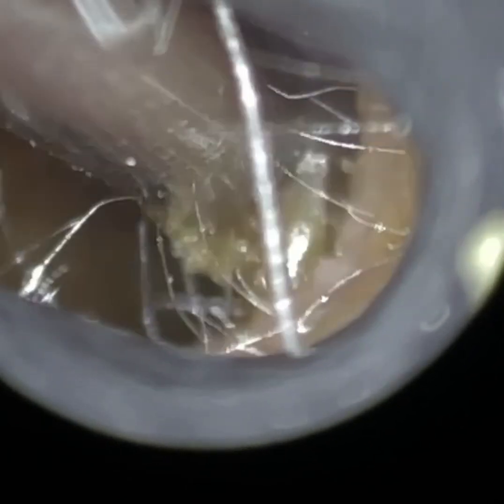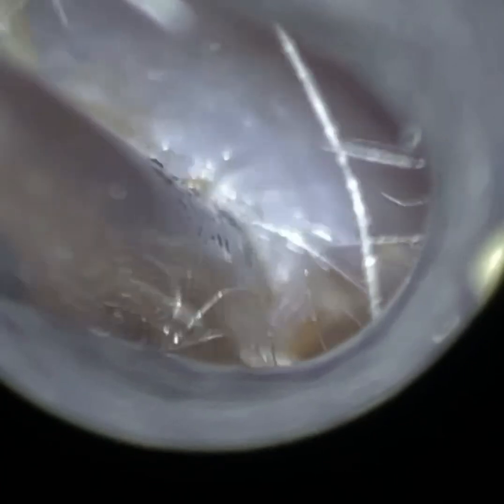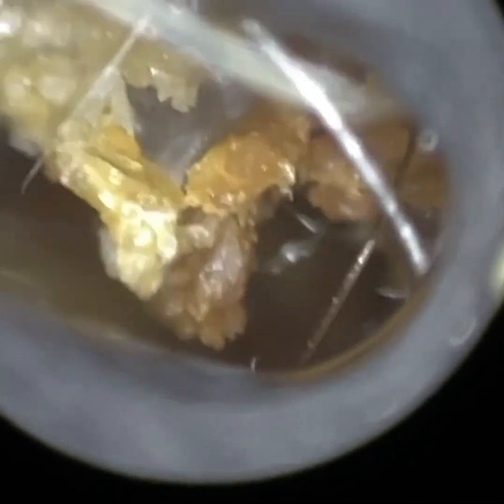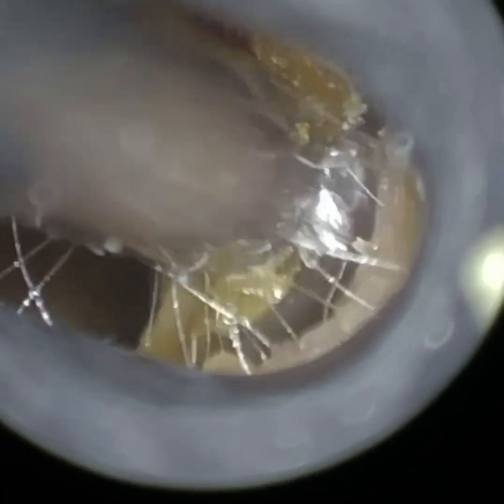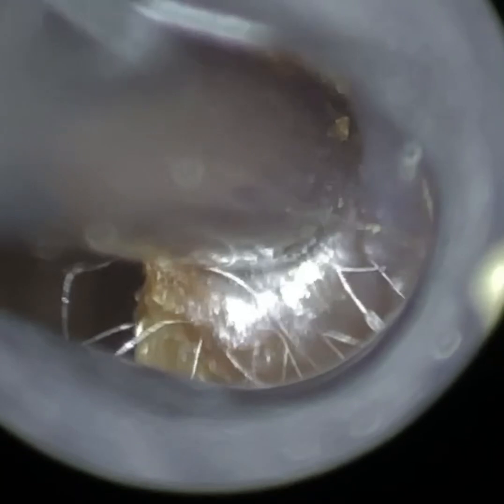What the ENT microscope and certain head loops do is artificially converge you to your interpupillary distance. In order to have depth perception with binocular vision, you must be able to see an object with both eyes. In the case of the ear, the ear canal diameter is less than our interpupillary distance, so the microscope and some head loops artificially converge your interpupillary distance so you're able to see wax with both eyes.